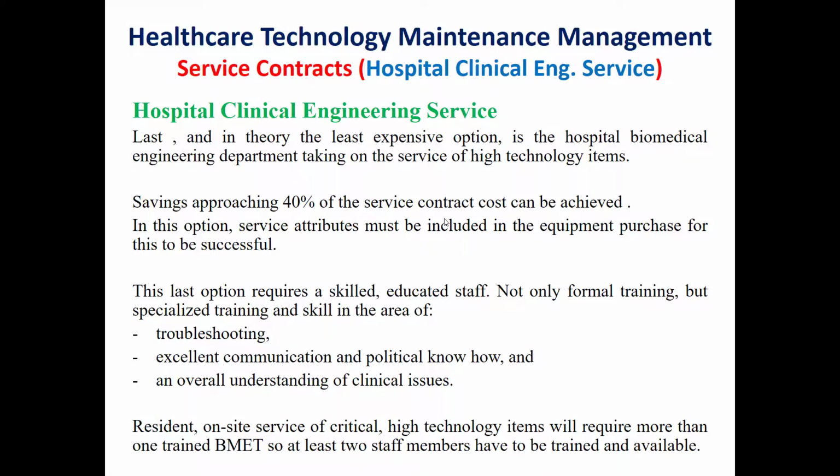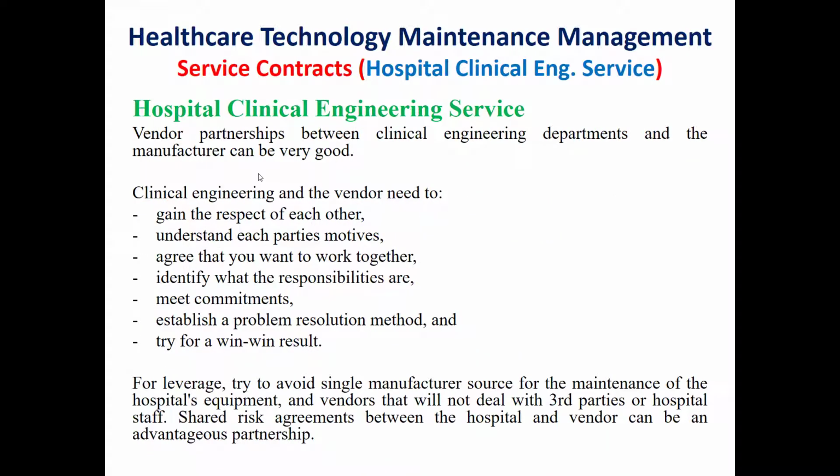Vendor partner: even in the case of the hospital clinical engineering service, a good partnership with the vendor is needed.